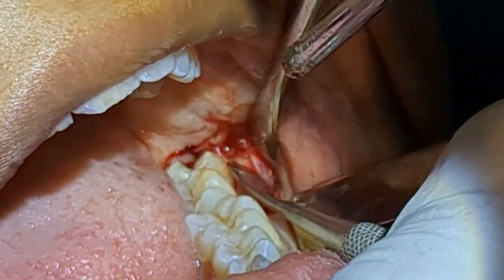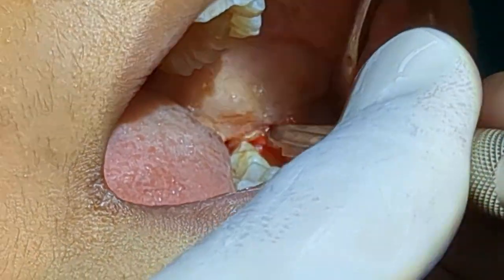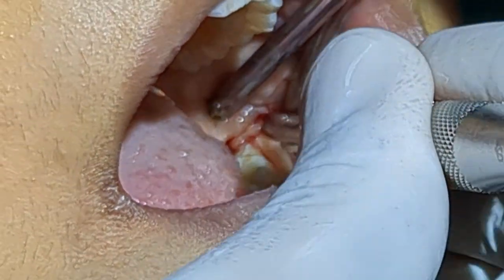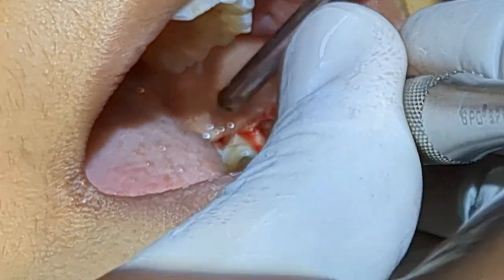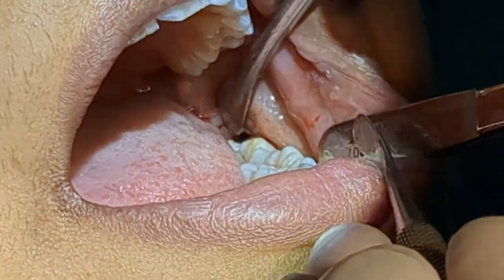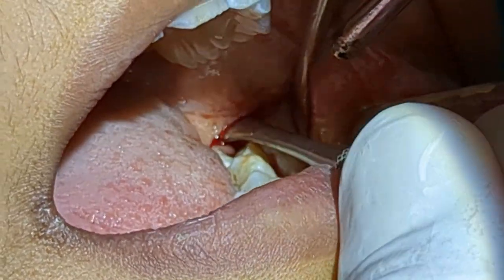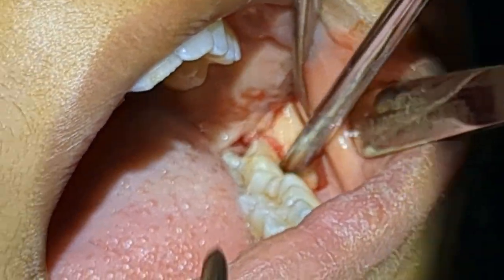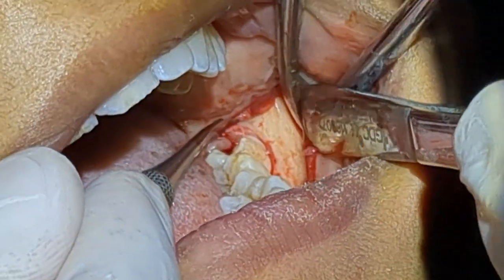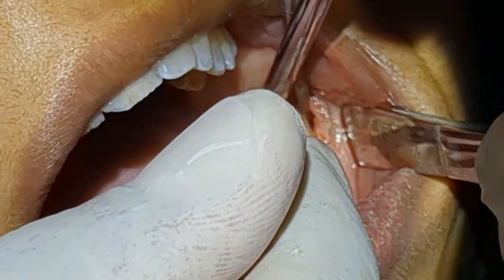There will be times when your distal incision is not complete — you can extend the incision in the periosteum with a relieving distal incision. The aim is to have adequate access on the buccal and distal bone, which you can see is quite accessible and visible now. I'm going to start with the bone guttering part.